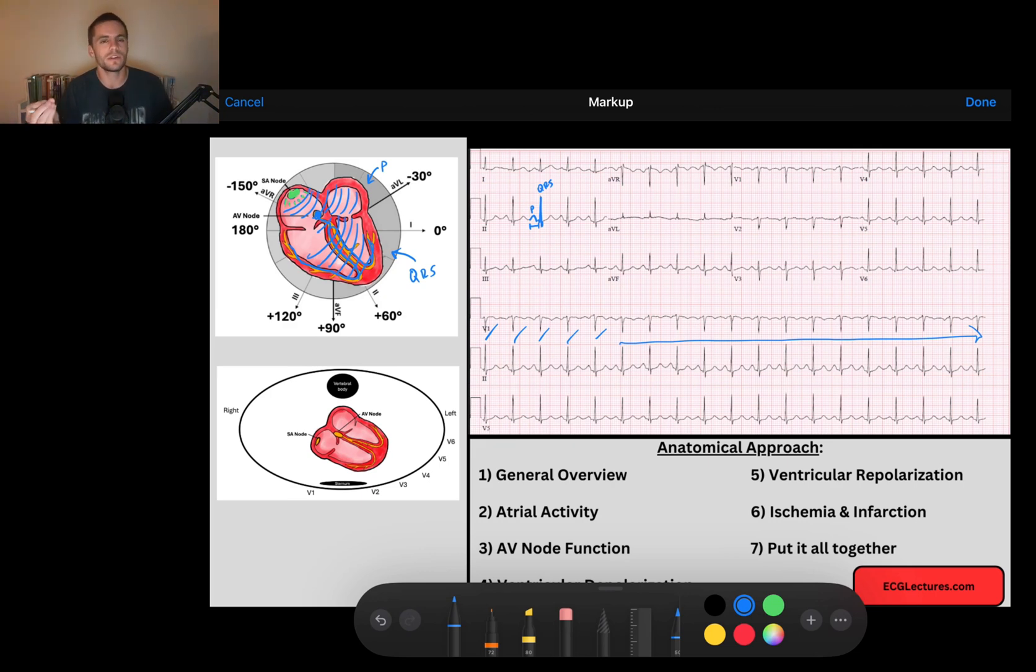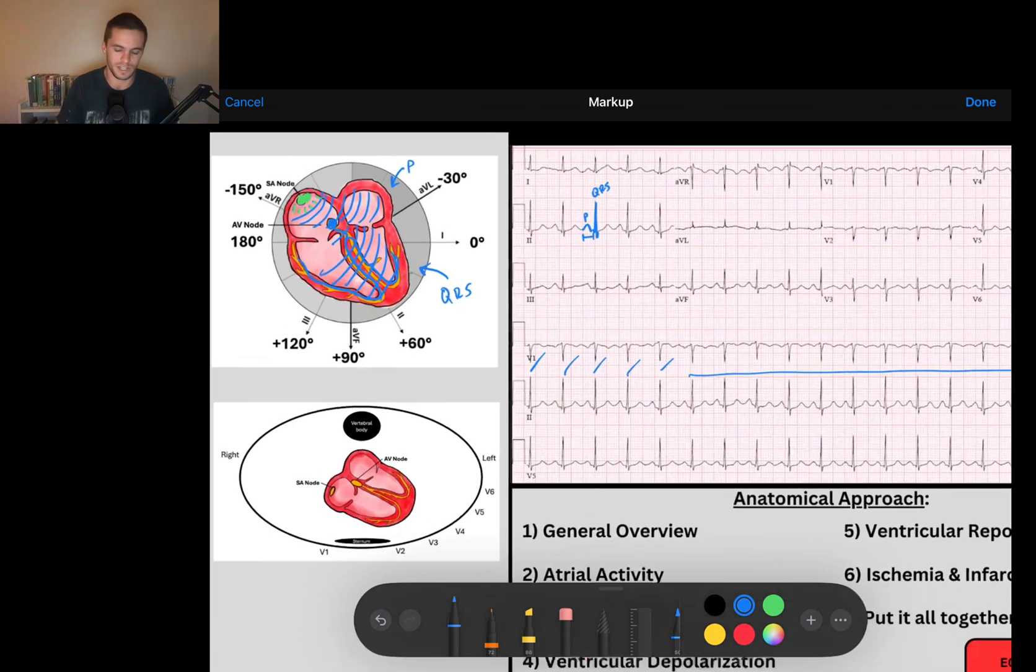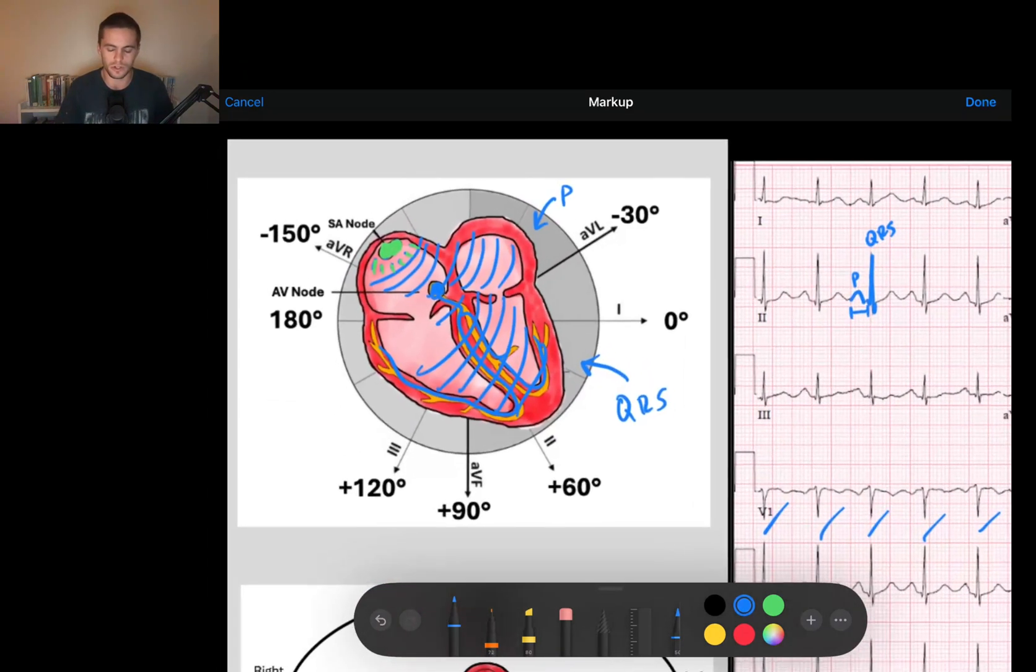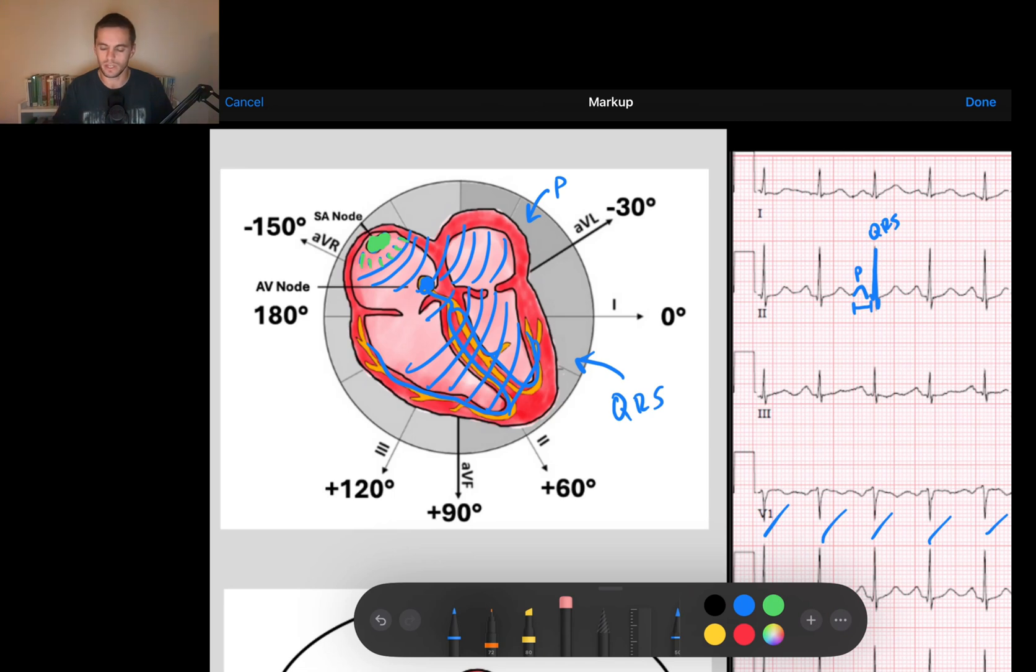And so maybe this is a sinus rhythm. Now, what are the things that we can look for specifically to say this is a sinus rhythm? Well, a sinus rhythm has to come from the sinus node, so let's talk about what things look like more particularly when they come from the sinus node.